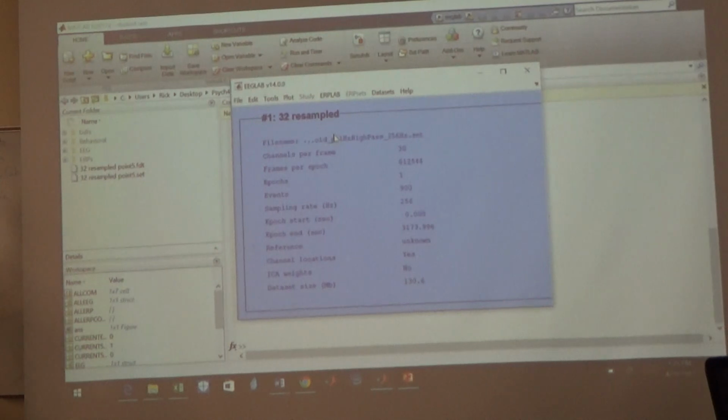The first thing that we just did to the data, yeah, we wanted to add channel locations. So this is the next thing we did. So add channel locations. And we did that by virtue of, within the scripts folder, it was within channel locations, and we had it so that the file was 40 electrodes. So that was our fifth.